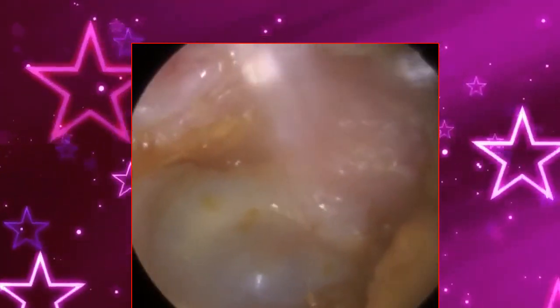So the occlusion's gone. Just a bit of dead keratin on the anterior canal wall and some near the eardrum. So I've just attached a fine end gauge. So just trying to get this near the eardrum first. That's in the anterior recess. There is some in the attic region, which I'll also remove in a moment.